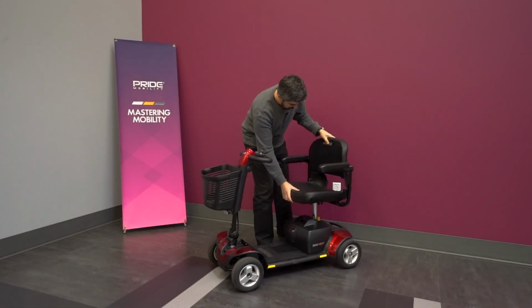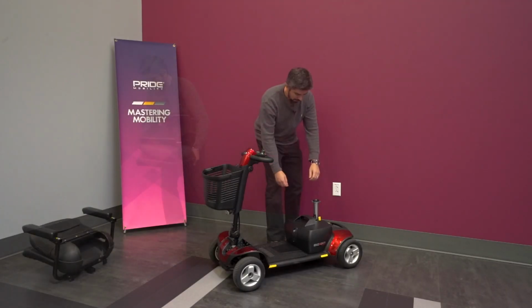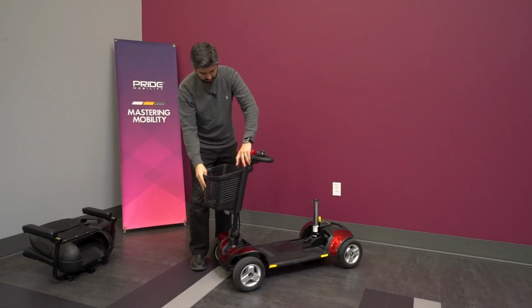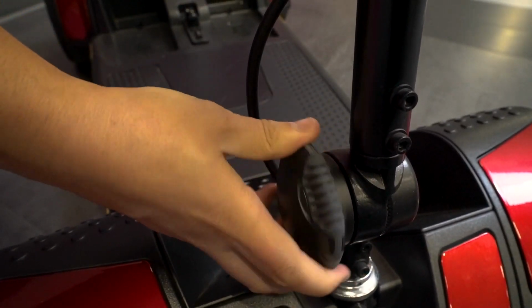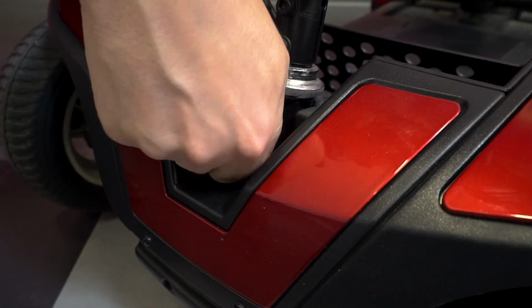First, fold down the seat back and lift the seat straight up to remove it from the post. Then, remove the battery pack by lifting up and detaching it from its Velcro holding. Remove the front basket by simply lifting it off the bracket mounts. Next, you'll loosen the delta tiller by turning this knob. Fold down the tiller, tighten the knob, and lock it into place.